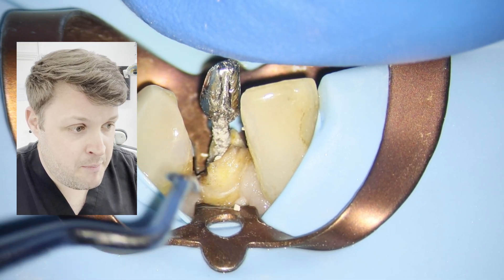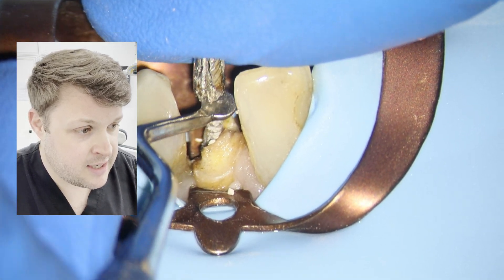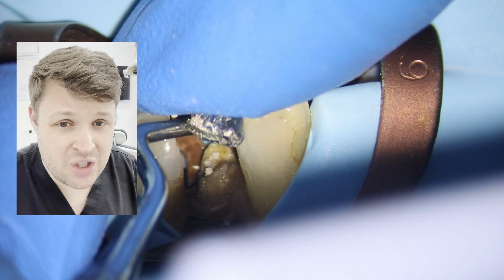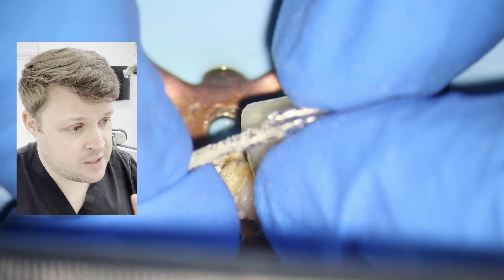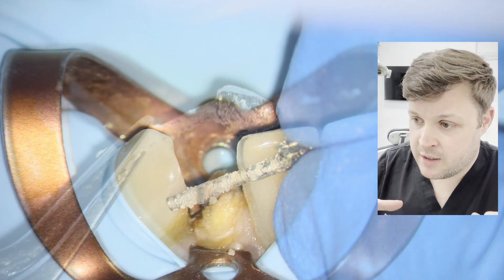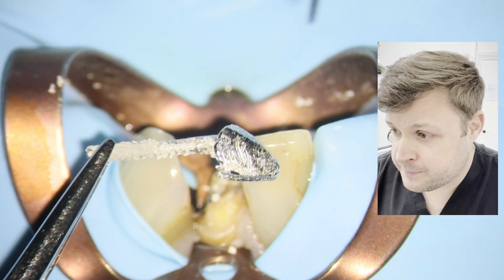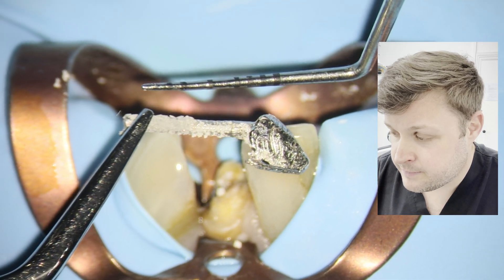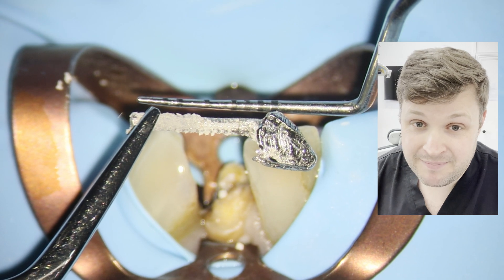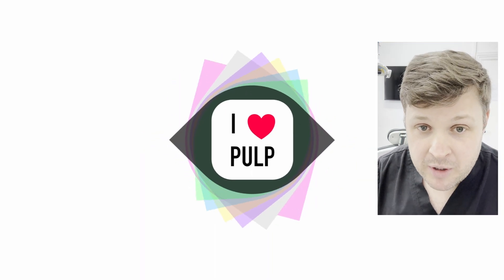This is the best feeling you can get — the post comes out. You can see how long that post is — it's huge. You can also see all the serrations, and all the cement that was around it too.